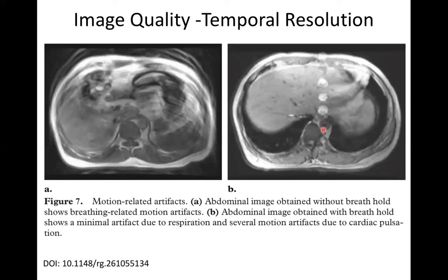And so it's brighter when the flow is coming into the slice, and then it's a little darker when the blood is stationary and staying in the slice. And that creates this. So that's not a blurring. However, over here, you can see there still is a blurring. And that's basically the heart is moving the tissue. It's sitting over here and it's moving the tissue up and down, causing the blurring on the side.